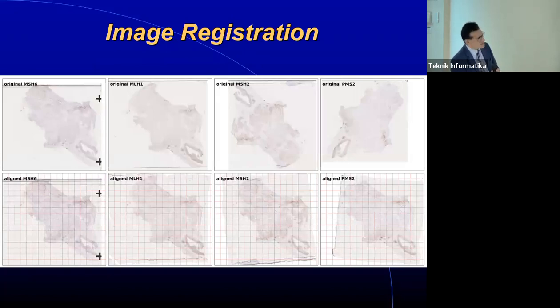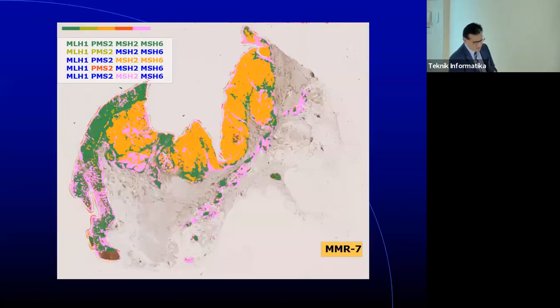You can't see this at all, but what this is showing is a number of images, all stained with different antibodies, from the same tumor. This is what I call a piranha. You can see the mouth here, but that mouth is over there and that mouth is down there. So the images are rotated and flipped. They're all stained with different antibodies, but if you have the right registration algorithms, you can unflip them, rotate them around and put them on top of each other. So you can do this, and this is the different antibodies all stained together and put onto one map.